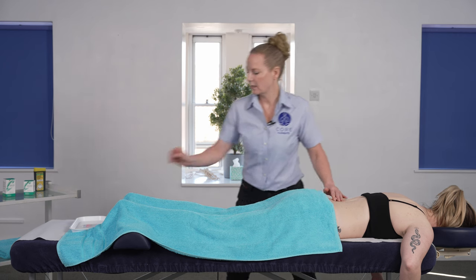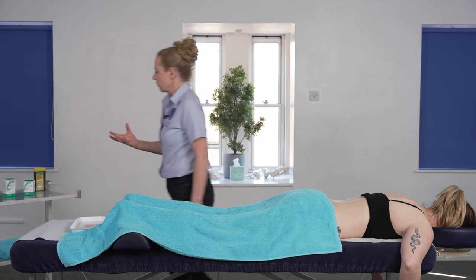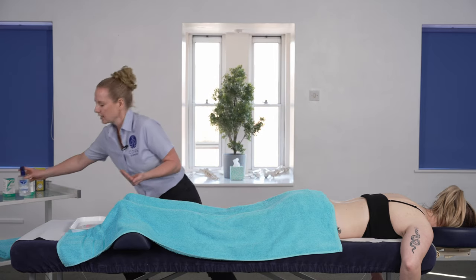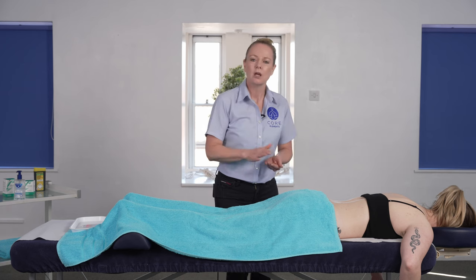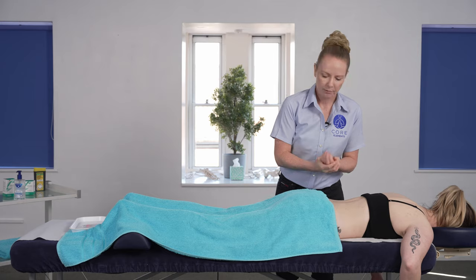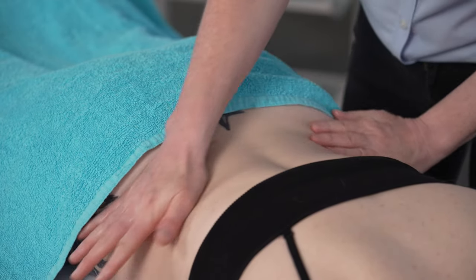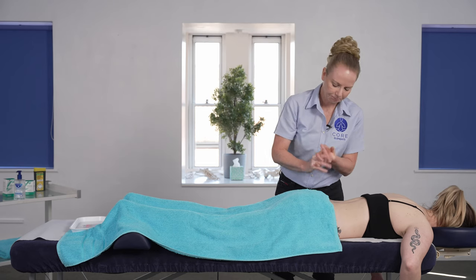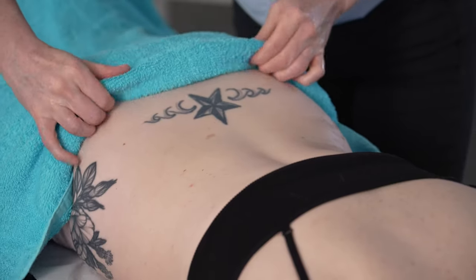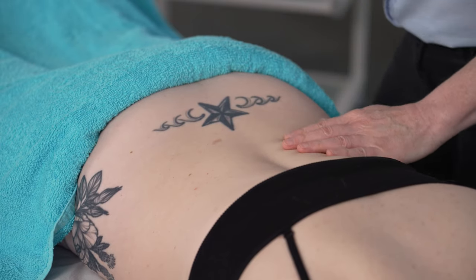Before we start needling we need to sterilize the area and sterilize the hands. In some areas it's preferred that we use gloves, but if you are focusing on doing combination treatment where you might be doing manual massage at the same time on another area of the body, then sometimes using gloves can be a little bit awkward. I've sterilized my hands and sterilized the treatment area, and we're just going to lower the towel down so that we can see that wider treatment area nice and clearly.